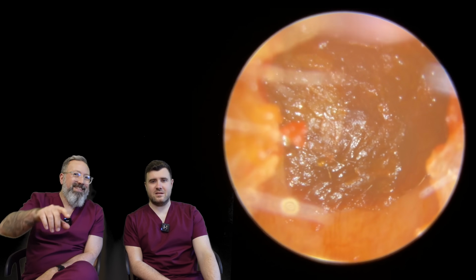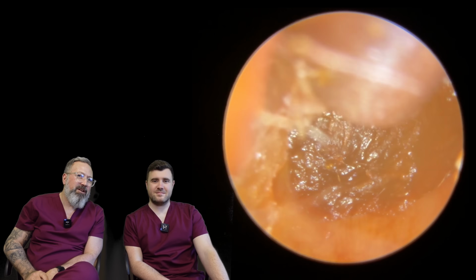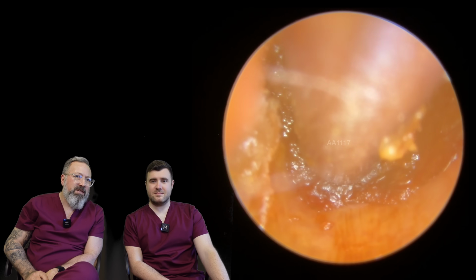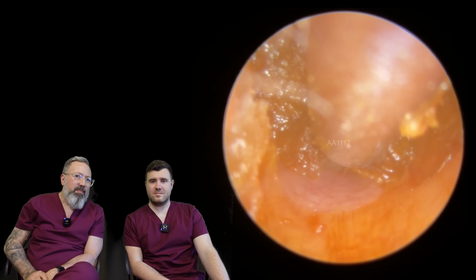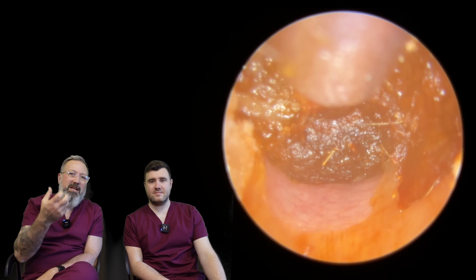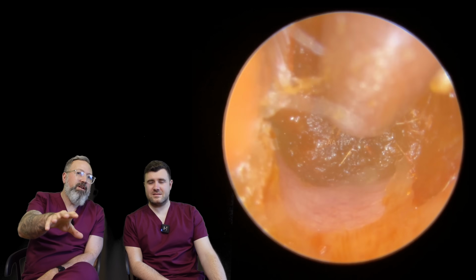There's a lot in there, there's a lot in there. That's the bit where I was thinking, oh, I wasn't expecting to see that deeper section, and that deeper section looks dry. It doesn't look as soft as that initial front section, but... Oh, it's a chewing gum. Yeah, it's that sticky, chewing gummy, kind of toffee consistency, this one. Not so bad if it comes away from the canal wall, I find.